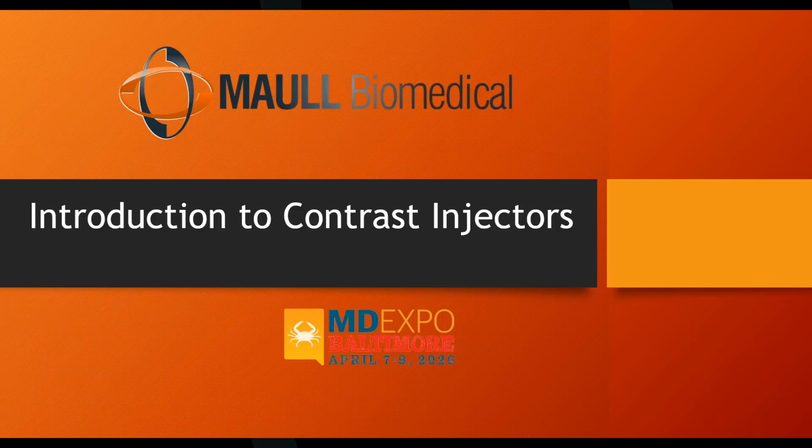Now, some of the radiation that goes into the patient is going to get absorbed by the patient, and some of the radiation that goes into the patient is going to pass through the patient and strike that piece of film underneath, on the other side of the patient. Now, the image of that film is going to start off as a white blank slate. What makes that film turn dark in some areas is the radiation. The more radiation that strikes the film, the darker those areas get. So the parts of the film that get struck by radiation turn dark. The parts of the film that don't get struck by radiation stay white, right? And that's how you get your typical chest X-ray, the ribs and the spine and all that sort of thing.